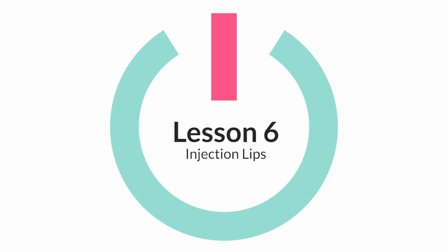In this lesson, we'll go over the injection of hyaluronic acid in the area of the lips and show some basic approaches for an aesthetic result.